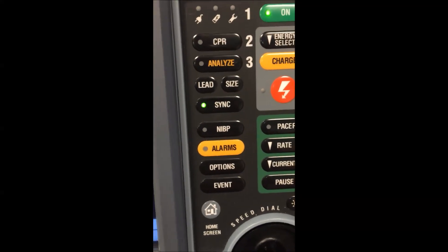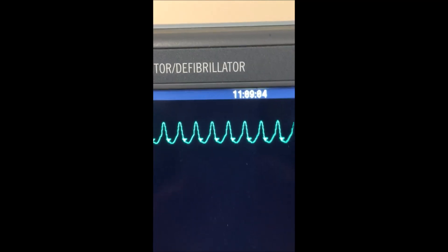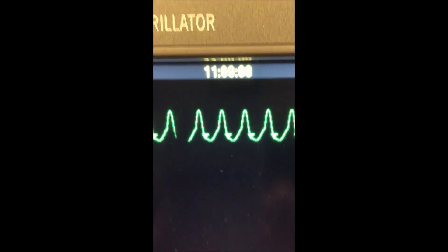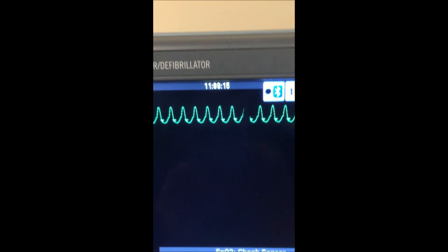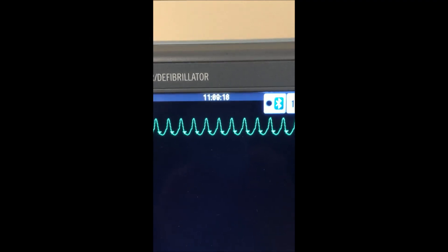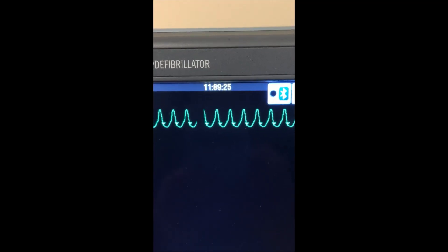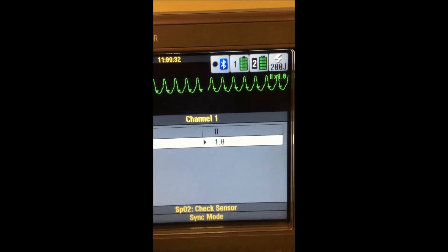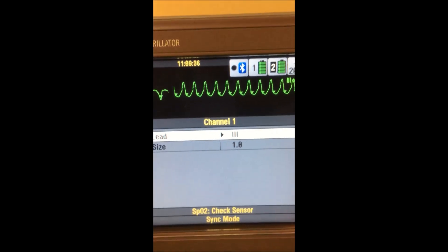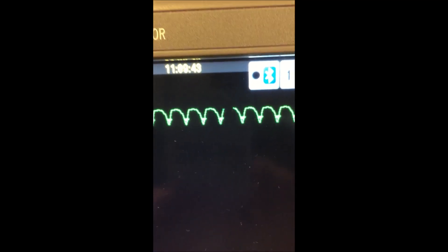To perform a synchronized cardioversion, we're going to use this switch. I'm going to press sync, and you'll see that the sync light is flashing. If we look over to the monitor again, we'll see that now there are what we sometimes call champagne glasses or arrows, and the monitor is using software algorithms inside it to do what we call flagging — telling you this is what I think is the R-wave, this is where I'm going to fire the energy. If for some reason you think that the monitor has chosen wrong, what you can do is change the lead, and that will potentially get you a better position on the QRS.